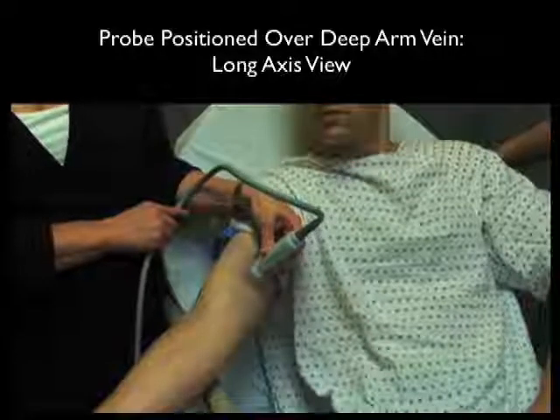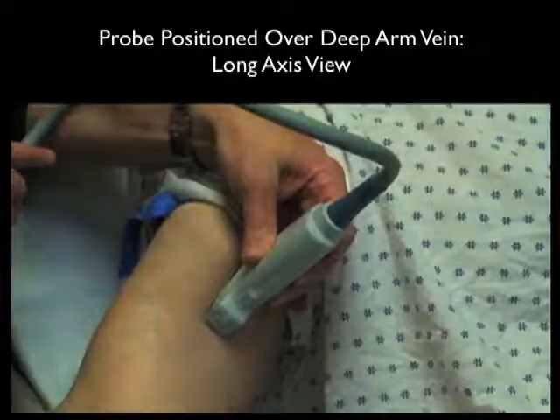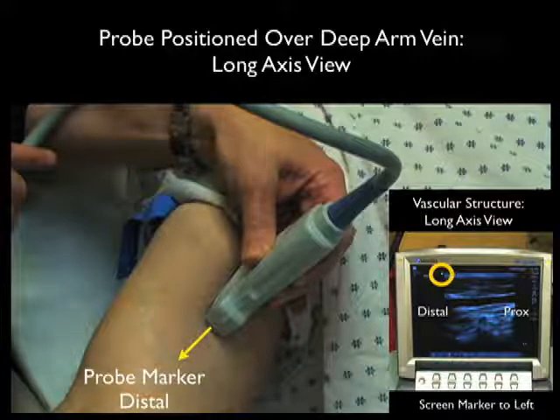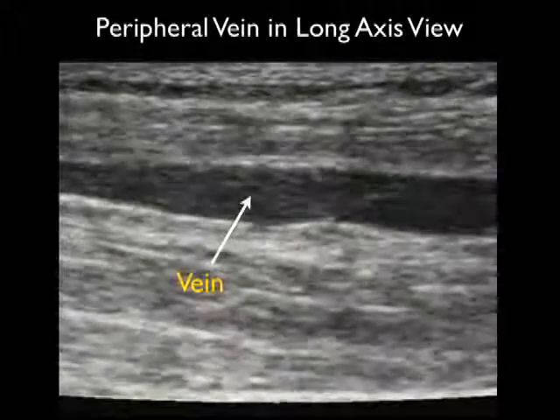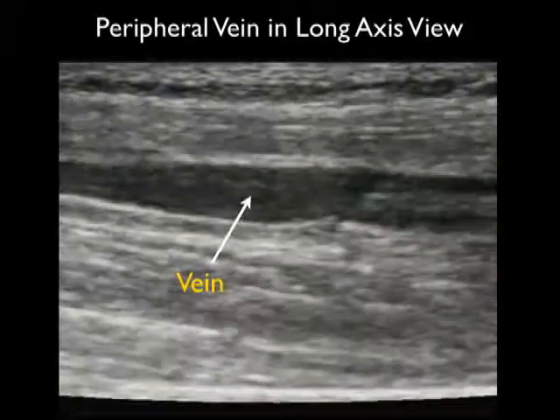Here's the high frequency linear array probe in a longitudinal or long axis orientation over the patient's upper arm, located over the more medial basilic vein. In this orientation, the probe marker goes distally, and the screen indicator dot is towards the left — so distal is to the left on screen and proximal is to the right. Here's a typical appearance of a venous structure in long axis: the vein has a tubular appearance, and blood flow is from left (distal) towards right (proximal). Looking in long axis gives complementary information about the vein.